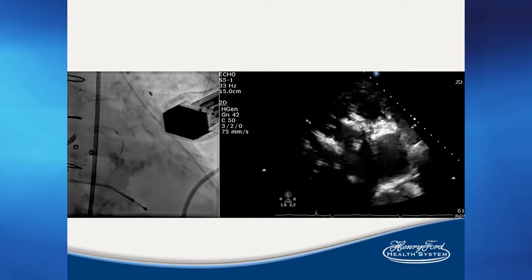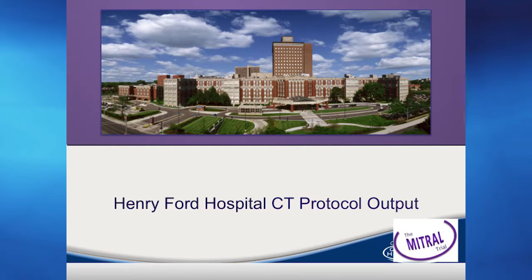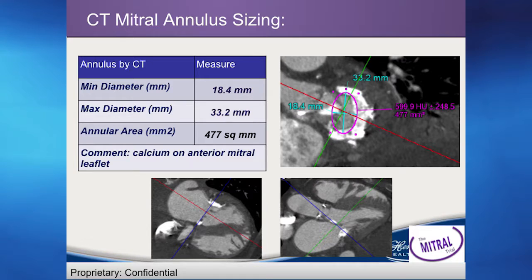So here we've done a preemptive alcohol septal ablation. This is part of a study that's being performed. It's a multi-center study being performed across the country. And Dr. Wang and her team have done a thorough analysis of, can you put a valve inside? What size valve does it have to be? What are the limitations? And this is after we've done the alcohol septal ablation.